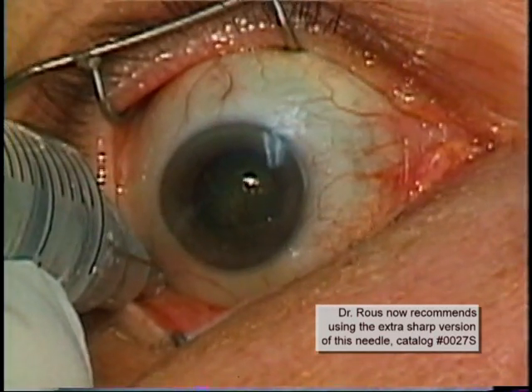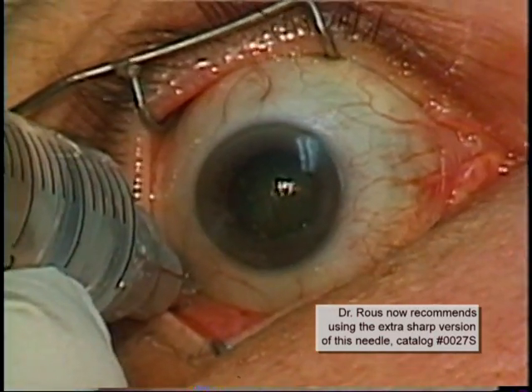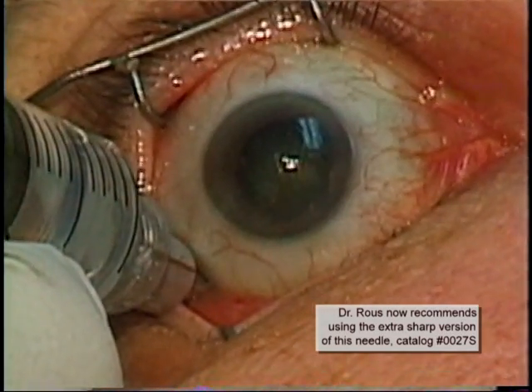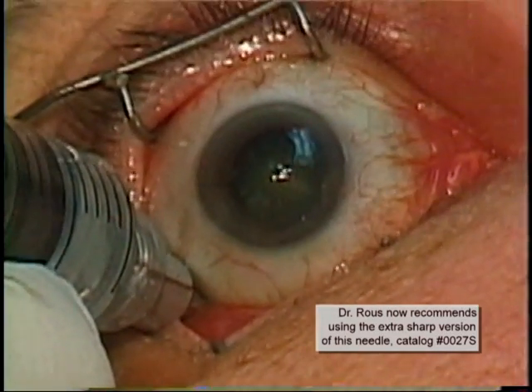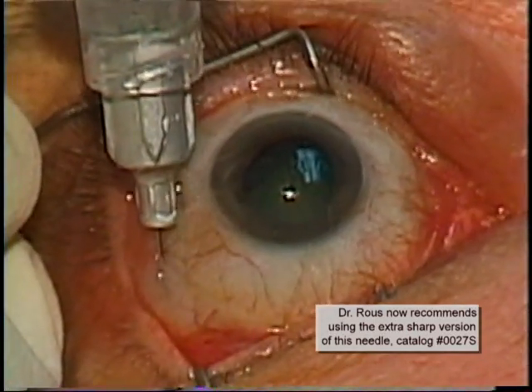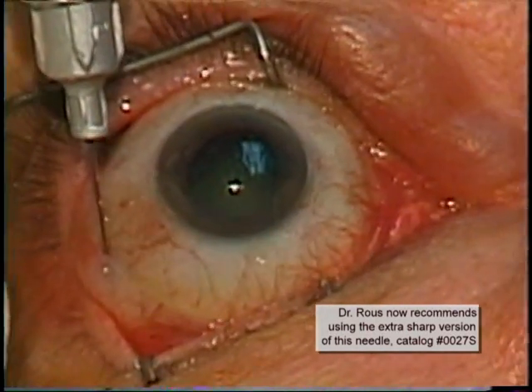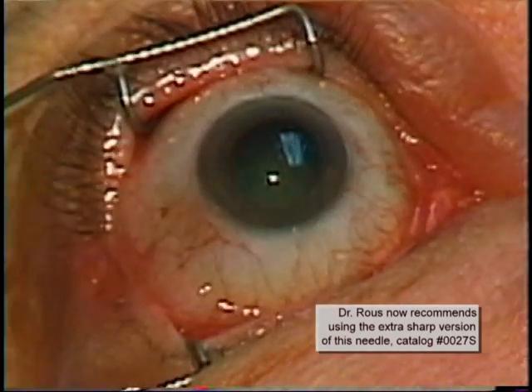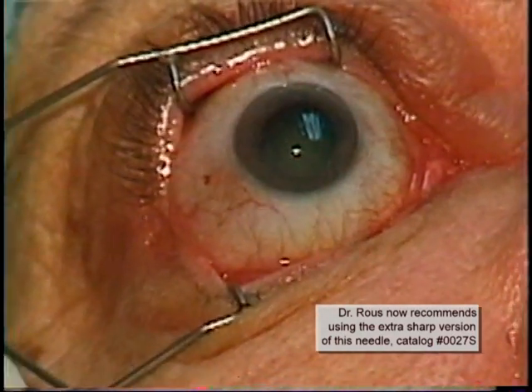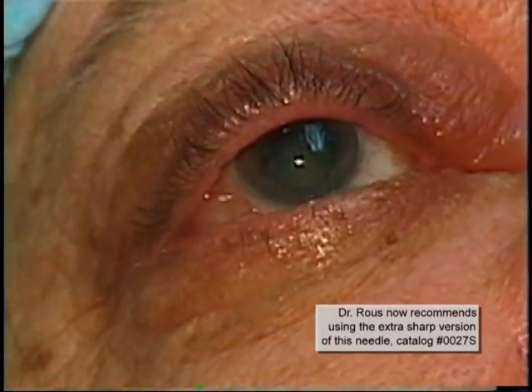Usually four cc's of anesthetic will be injected. Note that there is some parabulbar spread superiorly, leading to a mild amount of chemosis. If too much chemosis occurs, then only three to three and a half cc's will be injected. For this first case, there was only a minimal amount of chemosis and four cc's of the mixture was given.